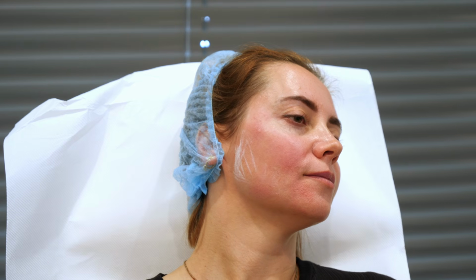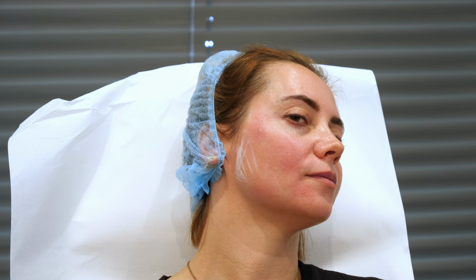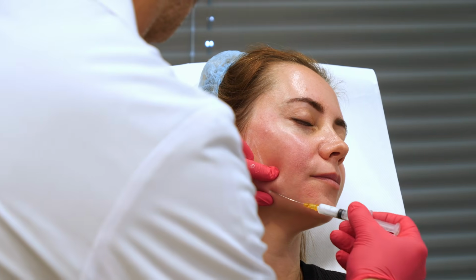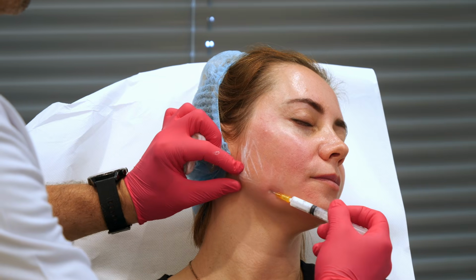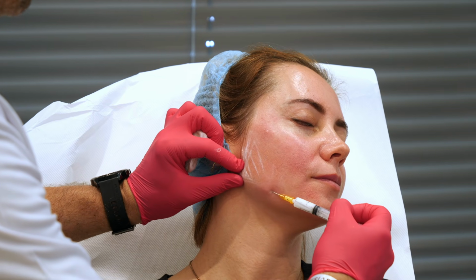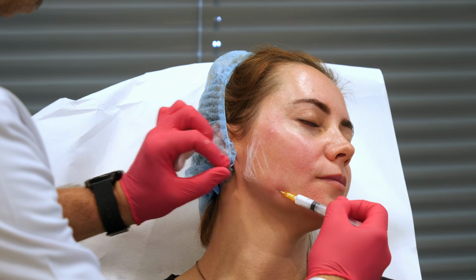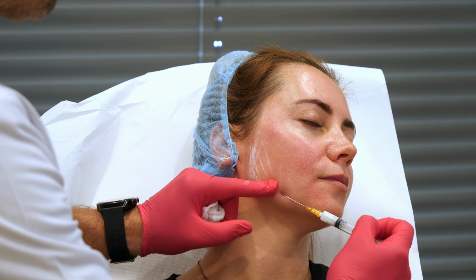This is the last 2 milliliters. From the same point, go in the opposite vector. Slow injection. We normally stop about 1 centimeter from the entry point.